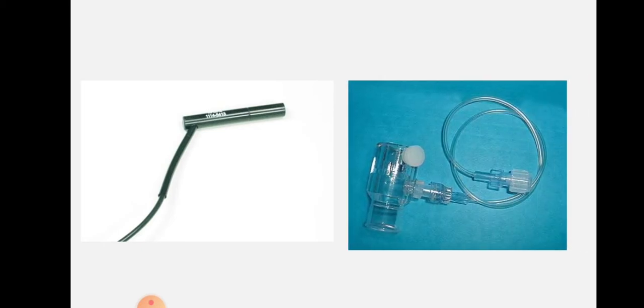Now there is some disadvantage of this contact scan method, that the examiner will need to do some applanation, that means a little pressure is applied on the cornea by that probe, so that the axial length of the eye which we get is a little bit lesser than the actual. So there is an error remaining. This is why another method came, that is the immersion method.